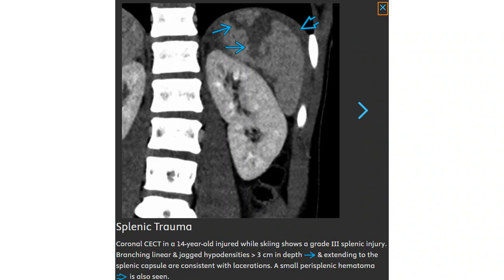Contrast CT in a 14-year-old with splenic injury shows branching linear and jagged hypodensity more than 3 cm in depth, extending to the splenic capsule, consistent with lacerations. A small perisplenic hematoma is also seen.